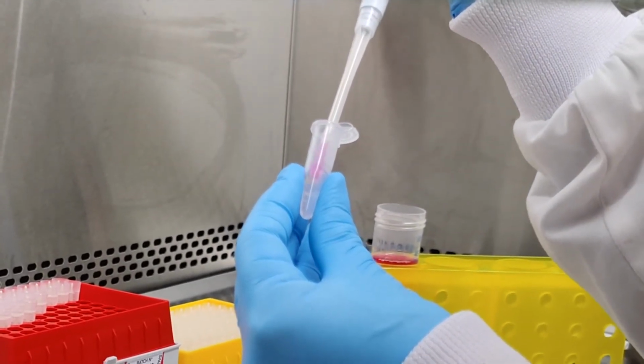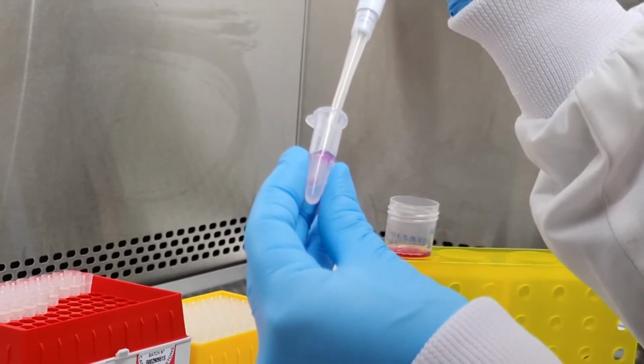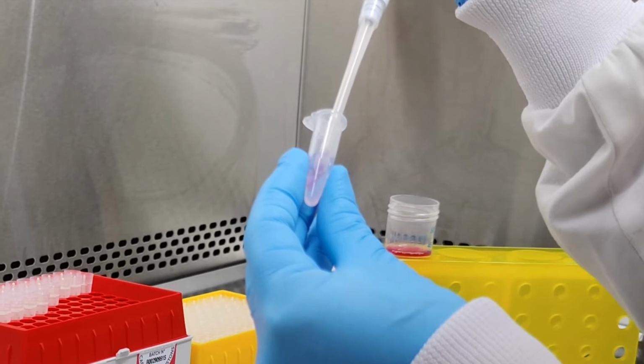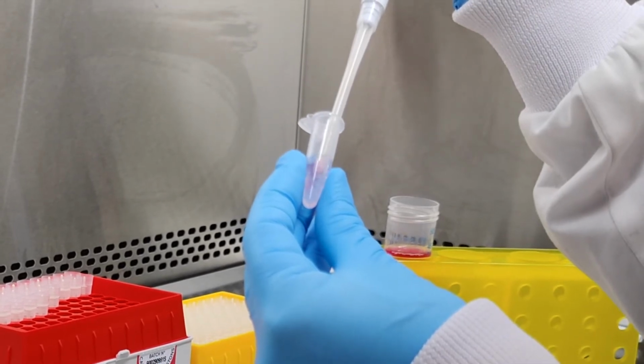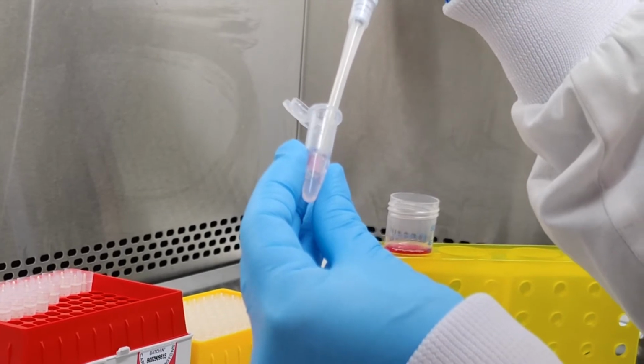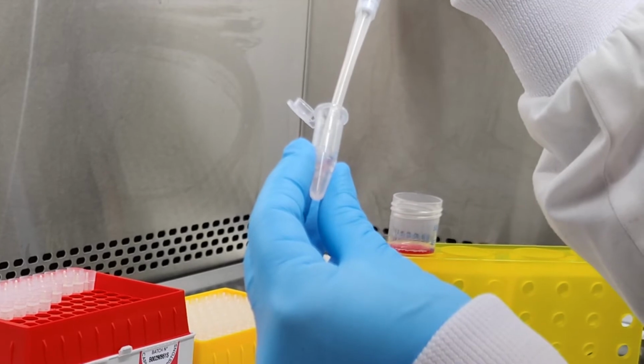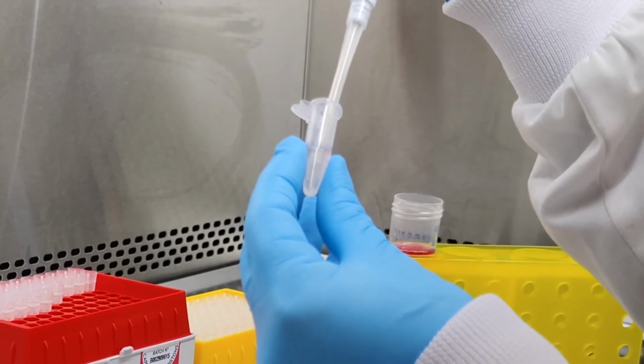Ensure your final mixture has a 1:4 media to gel ratio. Mix by filling the pipette with gel from the bottom of the microcentrifuge tube. Then slowly release near the top of the mixture. Always maintain the pipette tip within the mixture to minimize introducing air bubbles.